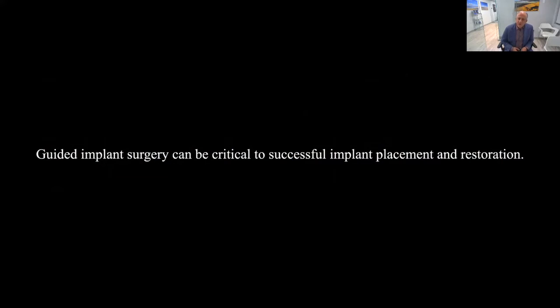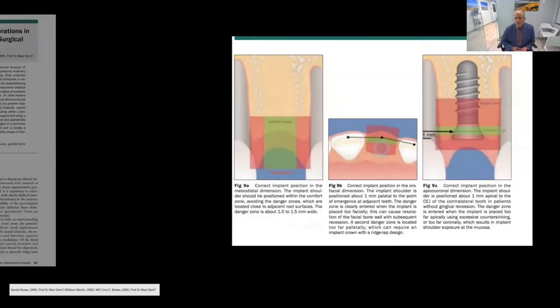So guided implant surgery, I think, can be critical in the successful implant placement and restoration in the anterior. And it's something that I really feel strongly about, so much so that I would say 99% of my cases are placed guided. And if we look at the studies now, there are numerous studies that show that guided surgery is just so much more accurate than freehand surgery.